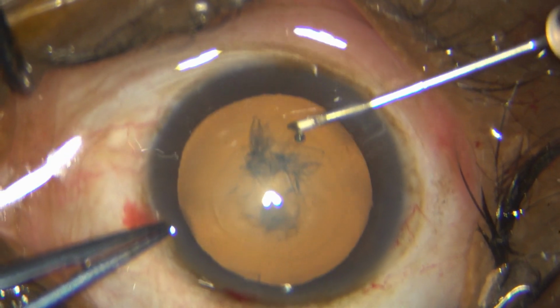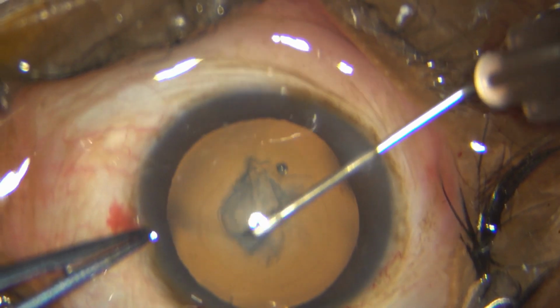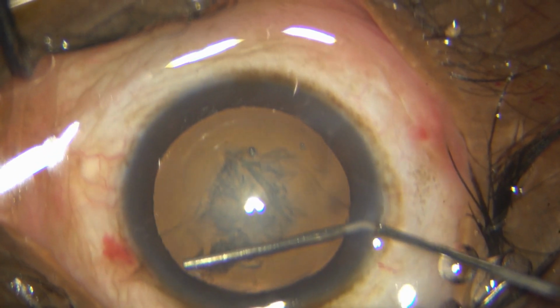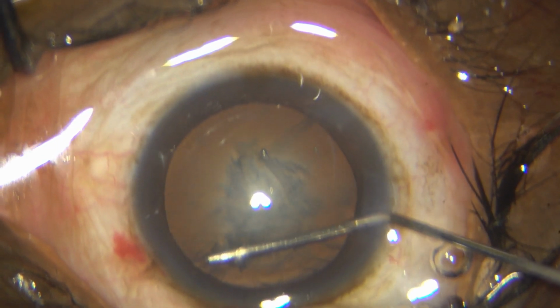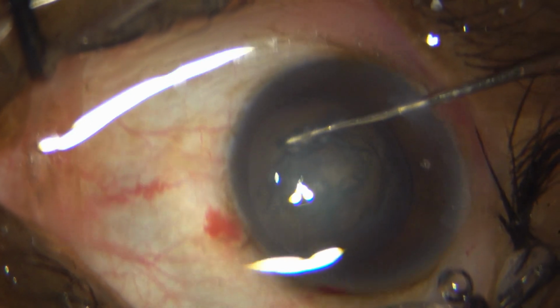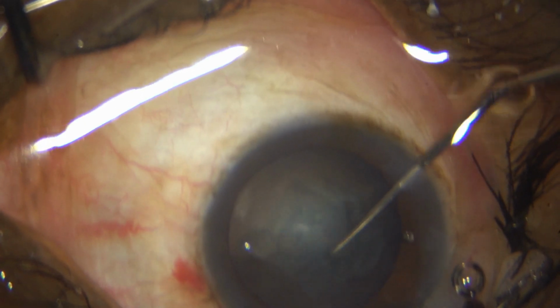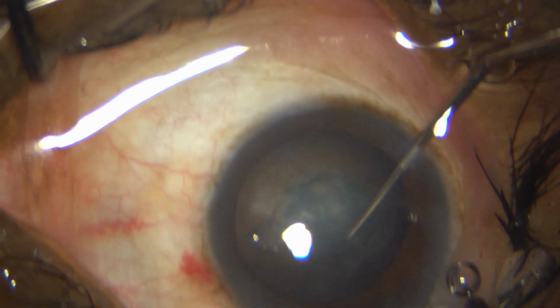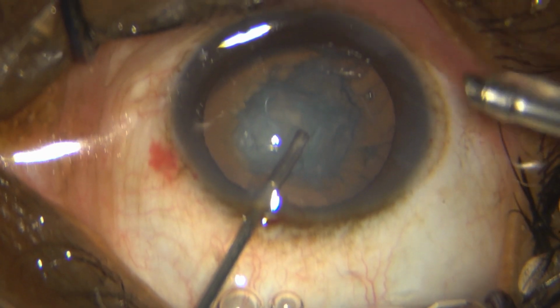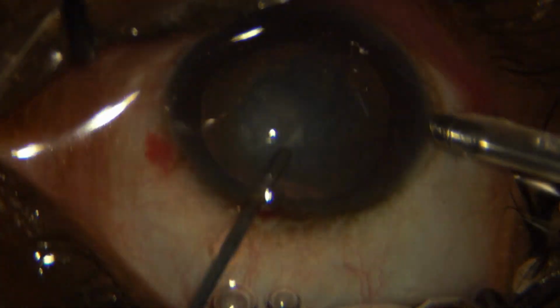So therein is the rexis, after which I go ahead and do my hydrodissection. That's a pretty good fluid wave that you can see. And then I checked if my hydrodissection is complete. With my dialer, I rotated the nucleus very well, and kicked up some cortex as well. As this is my first attempt with this lateral illumination technique, I wanted it to be as safe as possible. And here I put off my microscope lights and put on the endo illuminator, which is in my left hand, and that is the kicked up cortex that you can see.